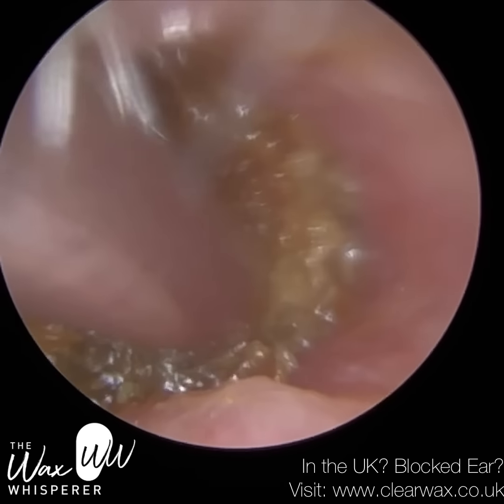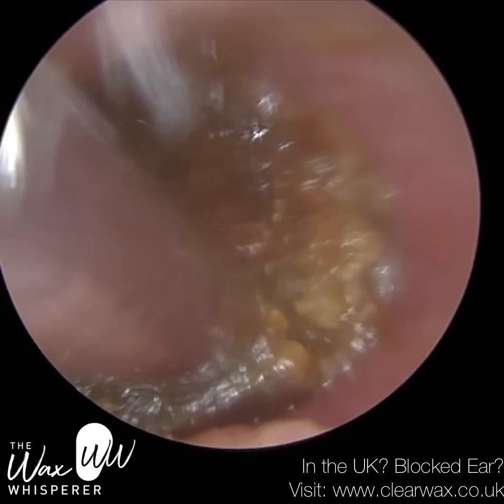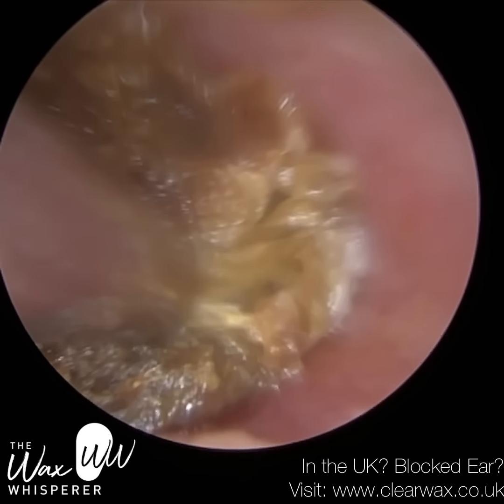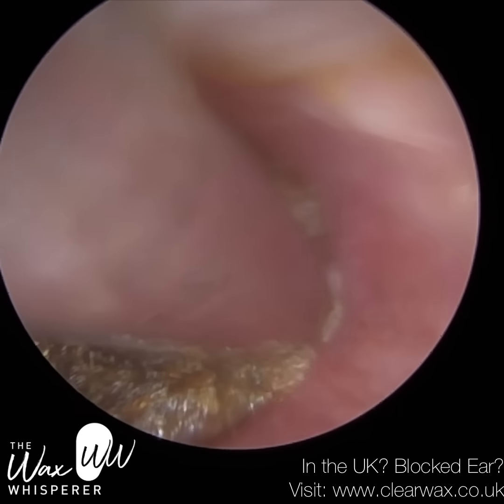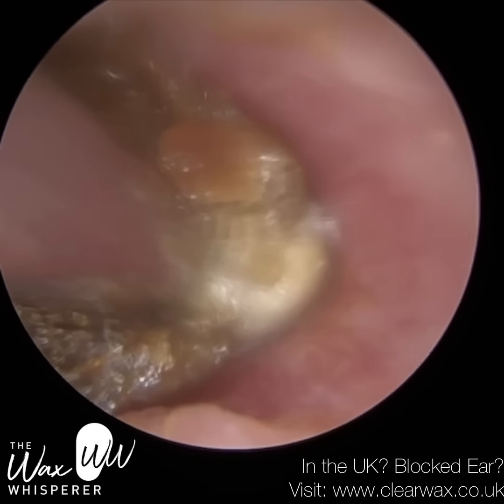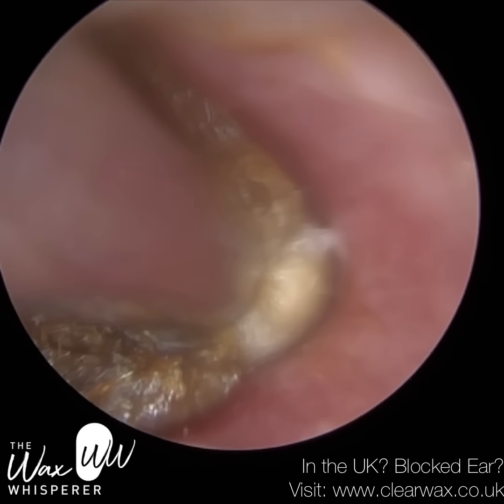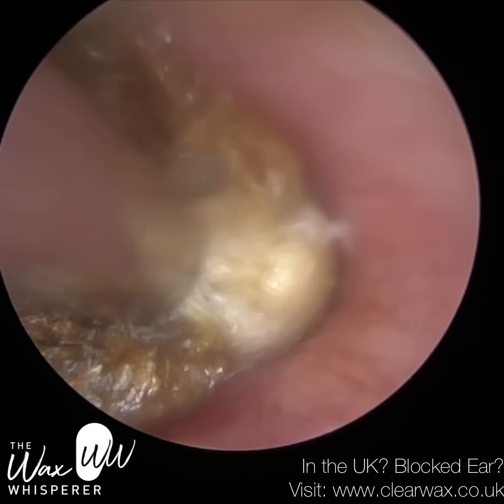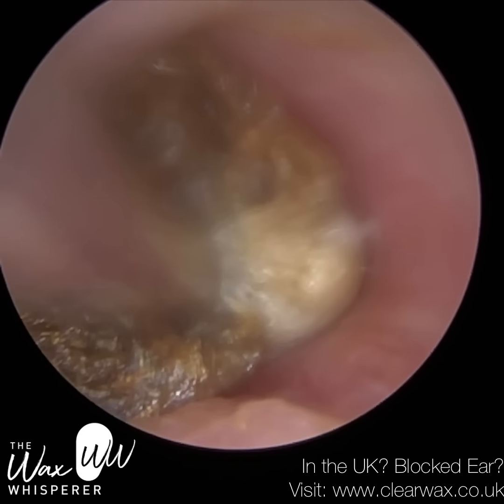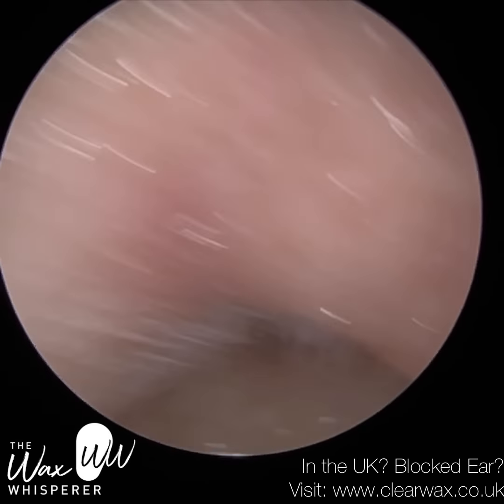So how do you remove keratosis obturans? Now, you must be able to identify it, because if you don't, it's going to be hard to remove, because there's certain things with keratosis obturans that you need to do. When you get a suction grip, you need to first of all go all around the perimeter of the ear canal and start detaching it from the canal wall. However, it's still stuck to the eardrum, so you need to then get a good suction grip and wriggle it left to right, up and down. You want to just loosen it. You've got to be patient, in other words. It's not one of those things you can remove straight away.